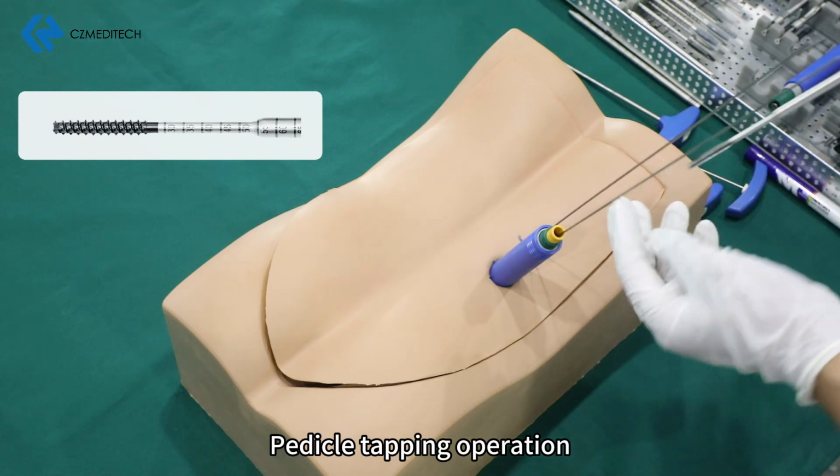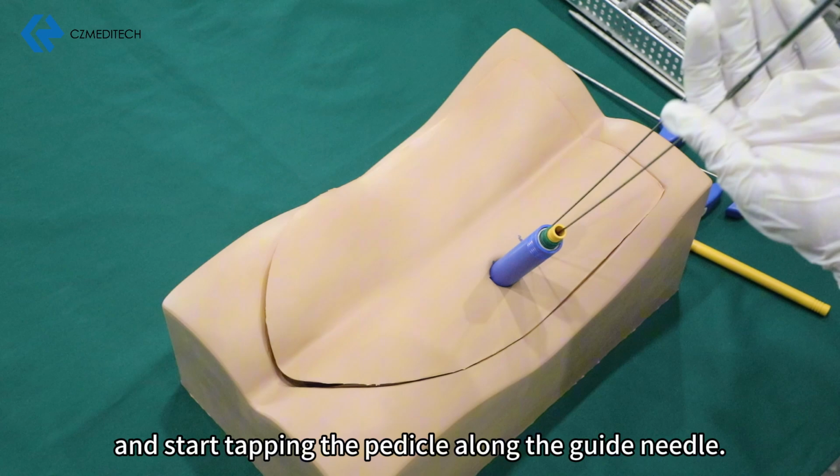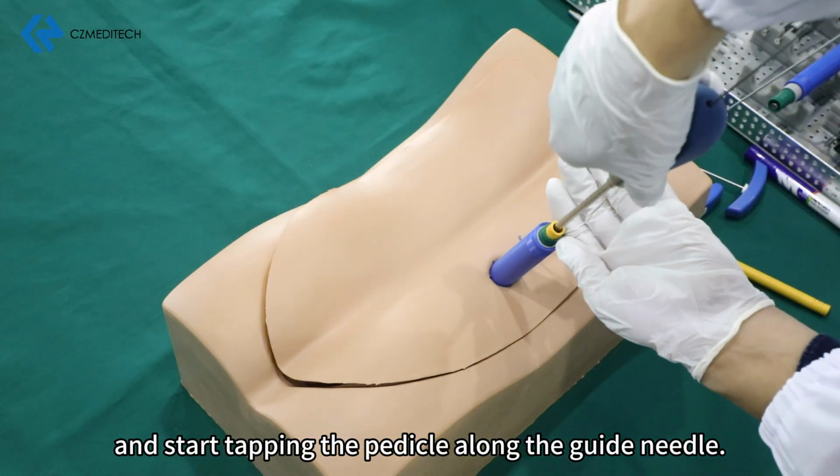Pedicle tapping operation. Select a small diameter tap, assemble a ratchet handle, and start tapping the pedicle along the guide needle.